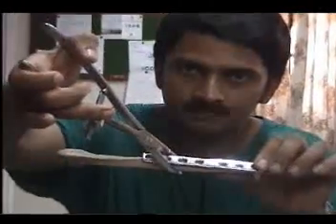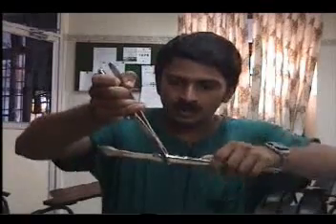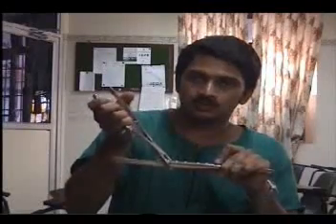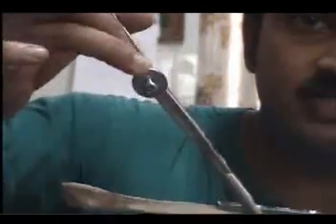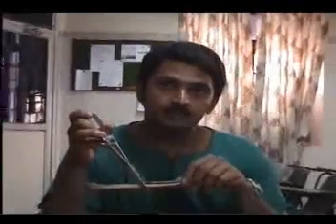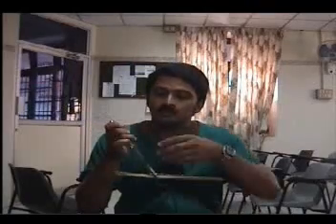The plate is then slid onto the Mani's clamp underneath it. Once it is fixed correctly in place, it is not tightened that much — just a little. You simply bend the Mani's clamp, and the two steps lock the plate in position. Another Mani's clamp is held on the other side and both are pressed down in an angular manner, so the fracture is held in position and so is the plate. The J.G. Mani clamp may not always be effective in all cases — it depends on the size of the bone and the size of the plate, and then you may have to use the conventional plate holding forceps.